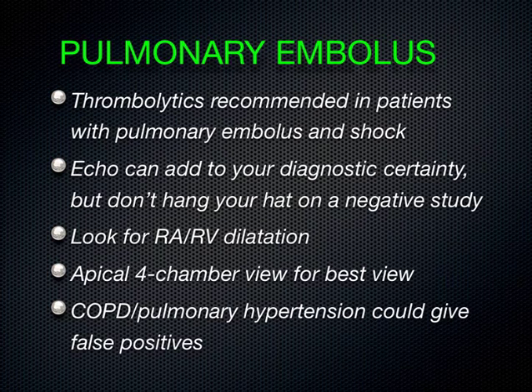So, we don't get a lot of patients with COPD at UC Irvine for whatever reason compared to other places where I've worked. And maybe there's just fewer smokers around Orange County than in other centers. I'm not really sure. But lucky for us with doing ultrasound of the heart, we don't have that confounder too much. But in the setting of COPD or pulmonary hypertension, you've got to be very careful how you interpret anything with echo.